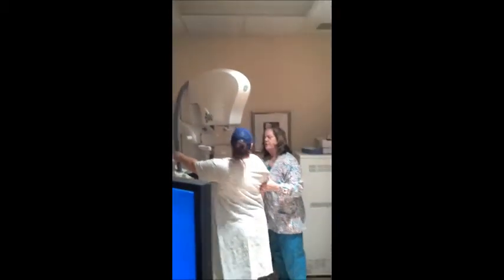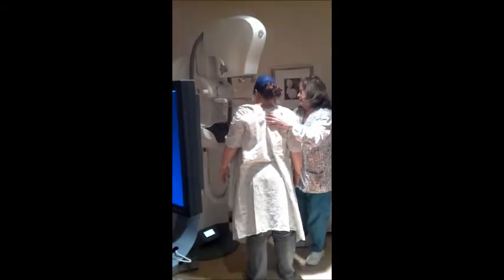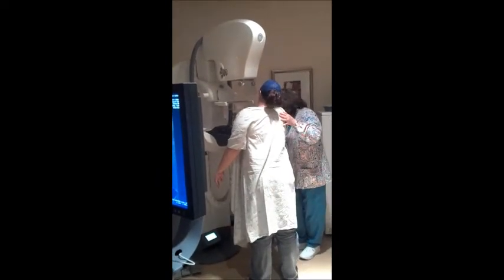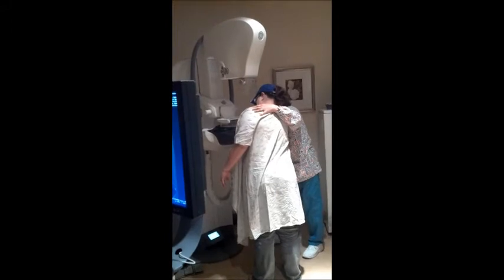Now these are digital, so it's different than what you had in 2002. So I will see the images immediately. There's no sit here and wait while we have to develop them. These are the newer machines that allow us to see our images almost right when we take them.